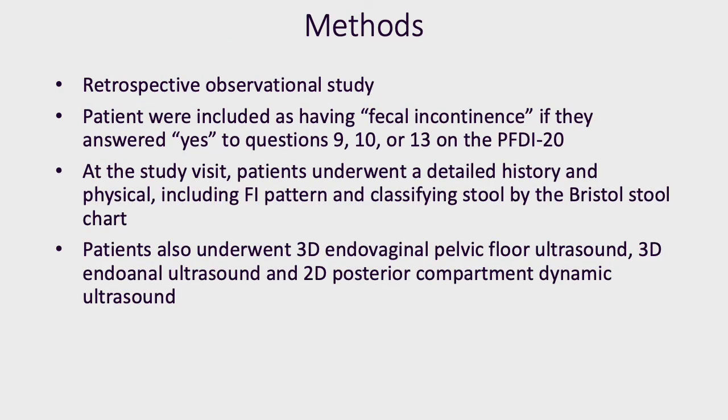This was a retrospective cross-sectional study. Patients were eligible that answered yes to questions 9, 10, or 13 of the PFDI 20. At the index visit, patients underwent a detailed history and physical exam. Endovaginal and endoanal ultrasounds were performed with 3D imaging and dynamic imaging of the posterior compartment.